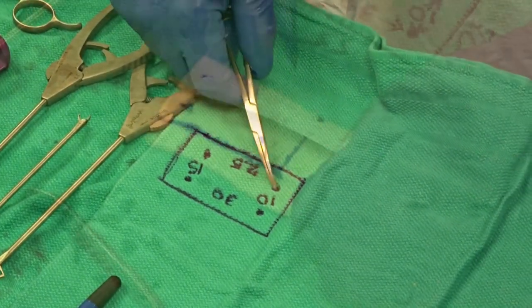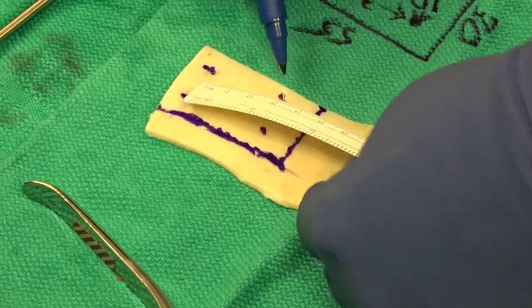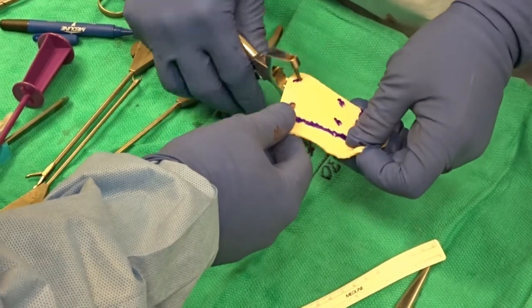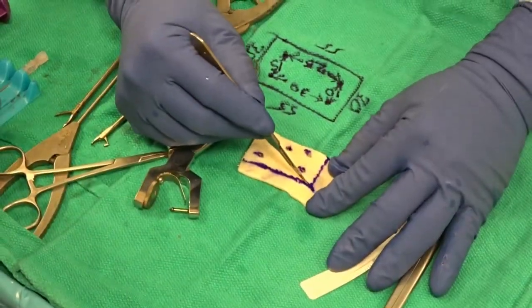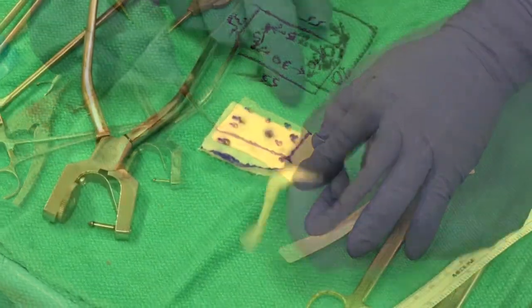The Arthroflex dermal allograft is 3.5 millimeters thick and is cut and prepared to the arthroscopic measurements from the anchors. Using a punch, holes are created at the four points corresponding to the four anchors to help the sutures slide through the graft without catching and twisting the graft.